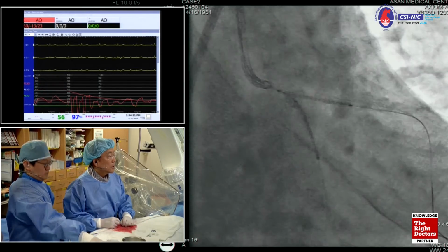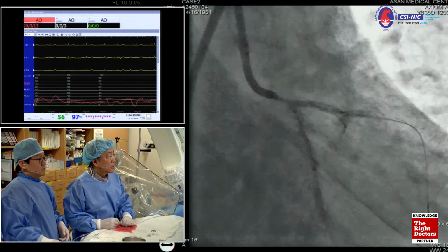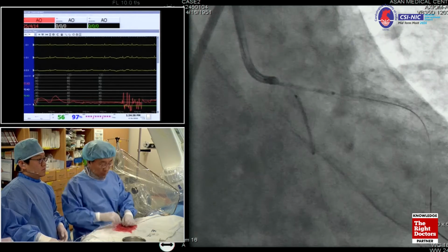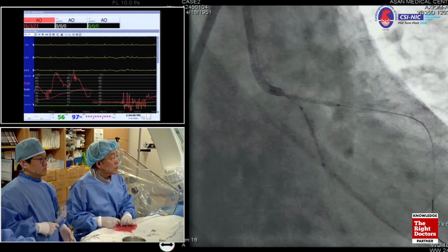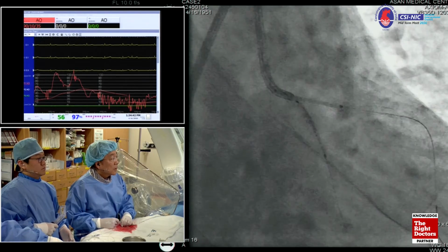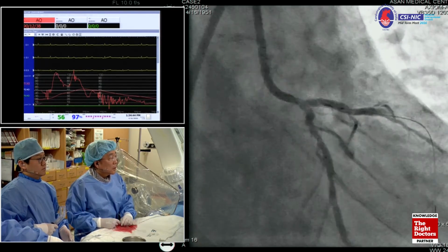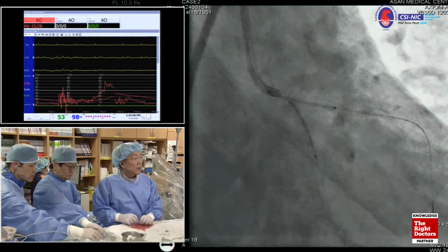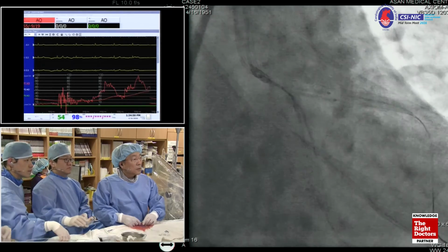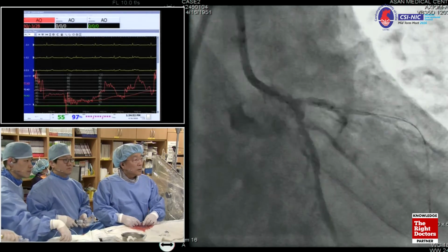All right, test. Everybody can do that. The mini crush, even if you've got some good concept. Test, please. Okay, circumflex is good, perfect length. And LAD-wise, test, please. Ostium, where is it? Okay, good.